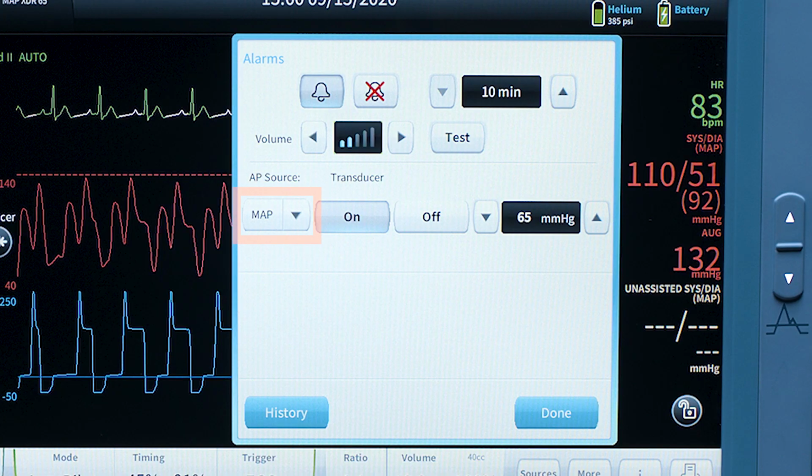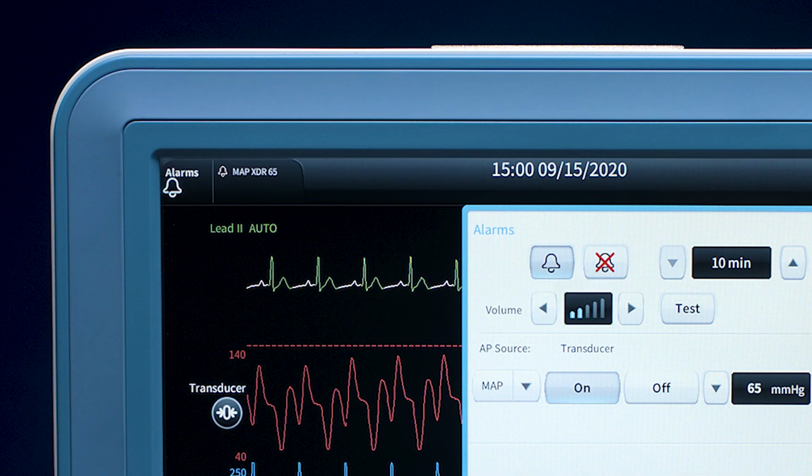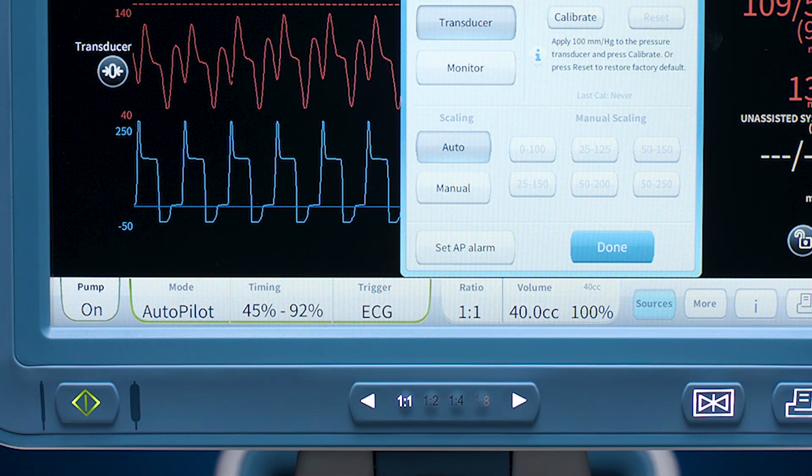The MAP is the default setting when the alarm is turned on initially, and these are low-limit alarms. An alarm will be issued when the selected pressure falls below the set limit. The limit can be adjusted up or down by using the increase or decrease arrows. The current limit displays in the Alarms tab for the selected parameter. Note, the user can also access the AP alarms through the Sources menu.